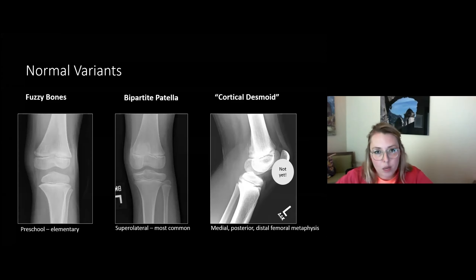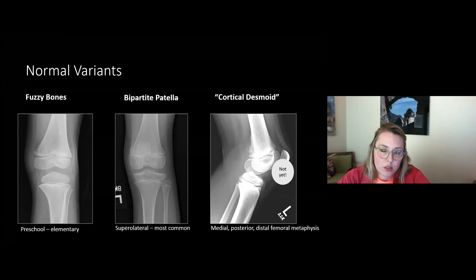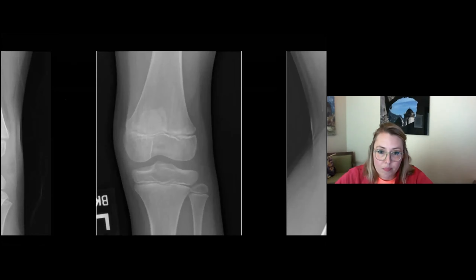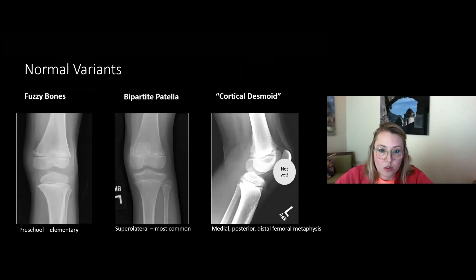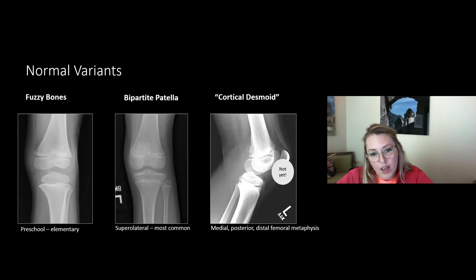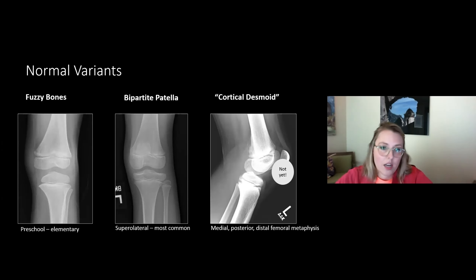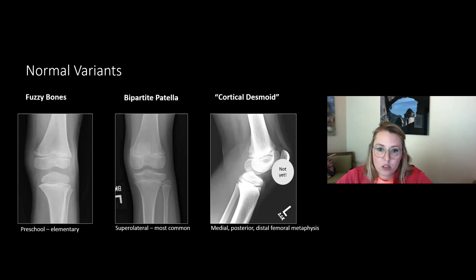A bipartite patella can sometimes mimic a patellar injury. Only 2% of the population has a bipartite patella. Of those, the most common variant is the superolateral, where a secondary ossification center in the superolateral quadrant of the patella never fully fuses. You can also have just the lateral patella involved, and most rarely — less than 1% of all bipartite patellae — the inferior variant.